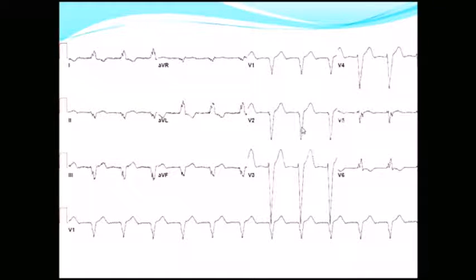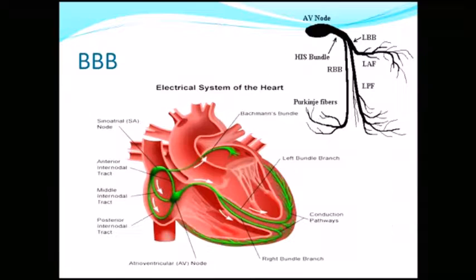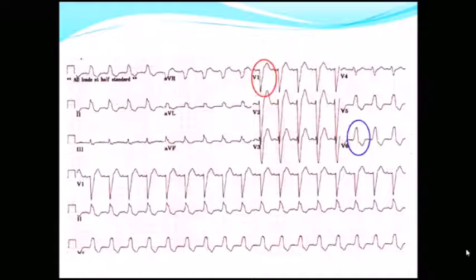So wide QRS complexes increase your clinical suspicion of a bundle branch block, not just a W or an M. This just reinforces what I was saying. This is too wide. This is below the isoelectric line, above the isoelectric line. Pretend this is a W, pretend this is an M. We have William, or left bundle branch block. Does that make sense?